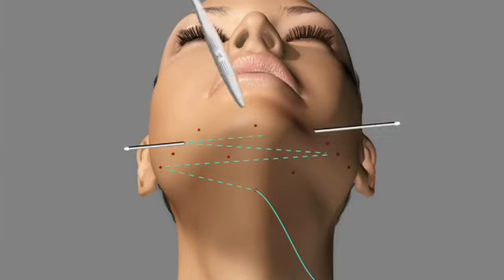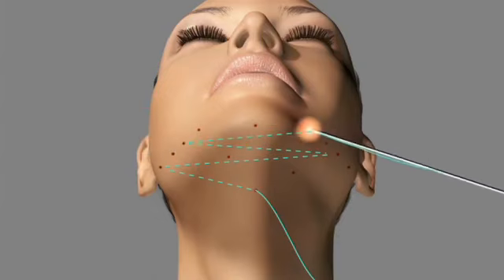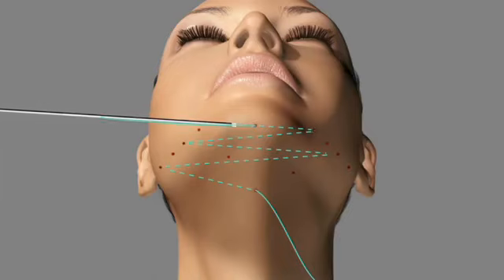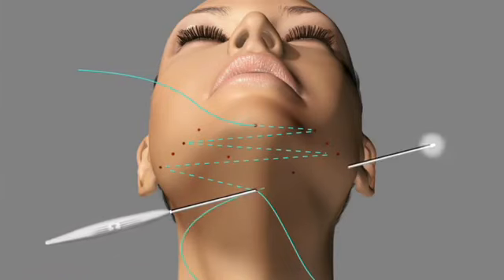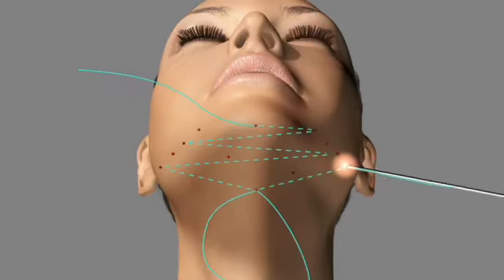It's important to note that with each passage of the rod underneath the jawline, if there is any difficulty, it is okay to puncture and make a new pivot point underneath the jawline. The rod was designed to be straight and should not be bent during this procedure. Therefore, if multiple pivot points are needed to travel around the curved surface of the jawline, they are necessary and will allow the easy placement of the suture matrix.